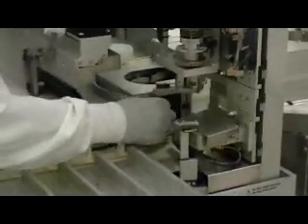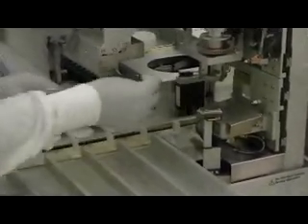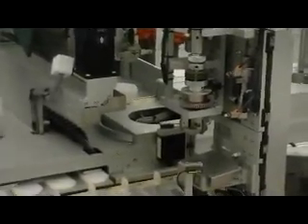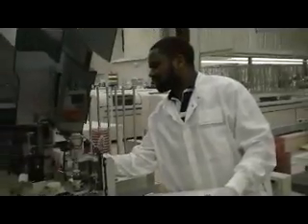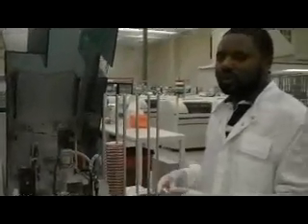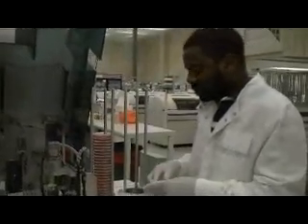And there is also a barcode reader. This is the sensor here, you also need to clean this. That's the one that will be reading the patient to see which patient it is. When you're done cleaning your sensors, there's also another sensor over there. If you look at your operator's manual, it will show you a list of all the sensors that you have.